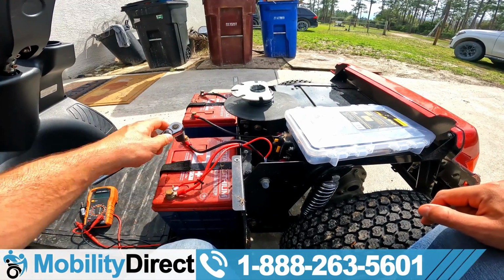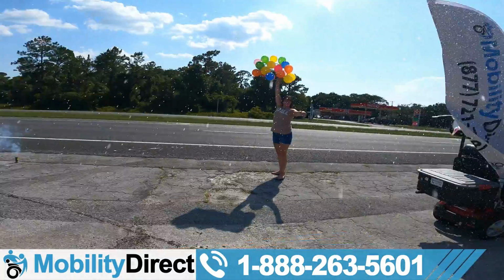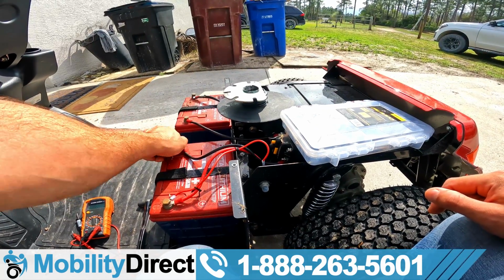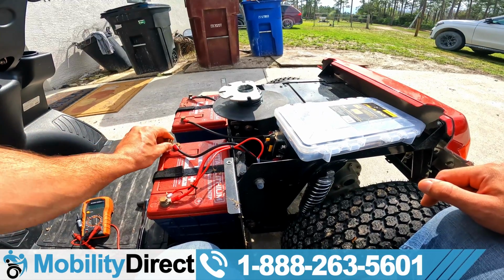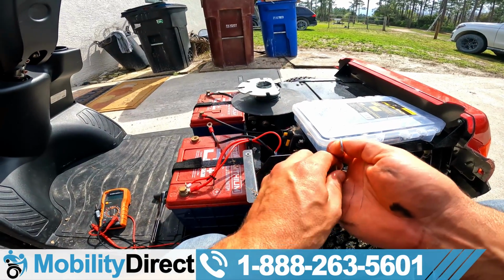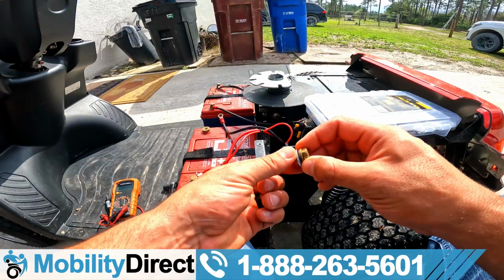All right, folks, so keep in mind, I do have lithium batteries here, and these lithium batteries are amazing. They're gonna give you like up to 80 to 90 miles of range. We actually beat a world record using this exact same scooter model and the same batteries, which are the Dakota 135 amp 12 volt batteries. Now it's awesome because they come with an 11-year warranty. So yes, they are a bit more expensive, but you get that 11-year warranty, okay? And not only that, they're gonna weigh half the weight of the traditional sealed lead acid batteries.